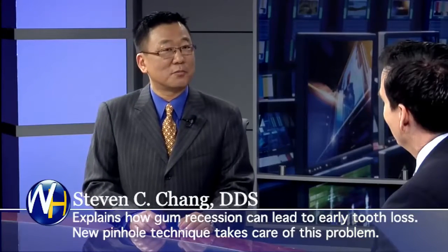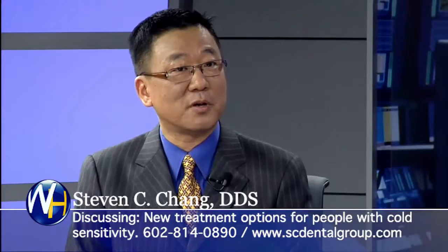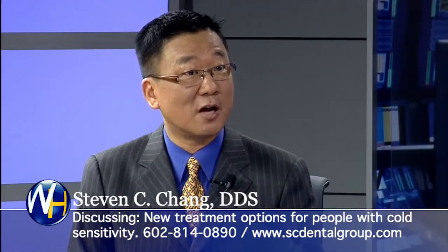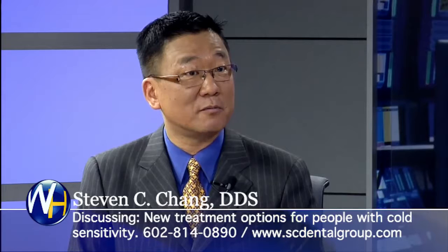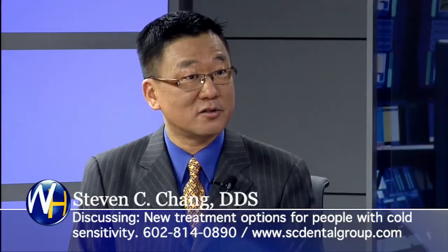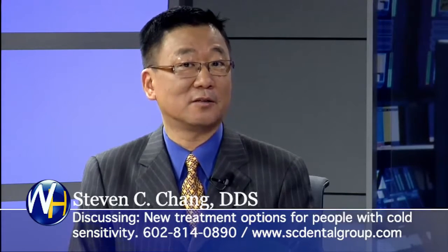PST, this procedure is the pinhole surgical technique. It uses very special instruments to bring the gum tissue down, create a space, and also uses the body's natural way to repair itself. And by using strips of a collagen membrane, it can make the gum fuller and longer and younger looking.